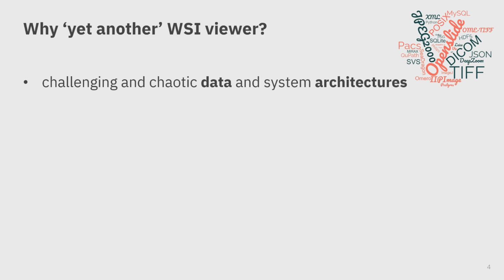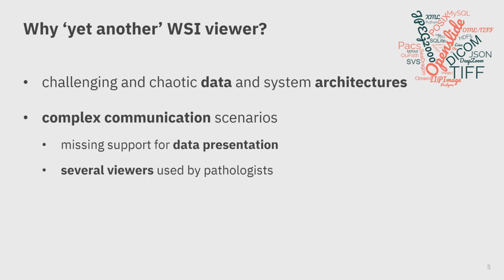We needed a viewer able to adjust to various, often ad hoc architectures. Commercial software is typically costly to adjust and inflexible. Ad hoc solutions usually consist of a combination of several software solutions, causing communication and compatibility issues, such as employing several viewers for different purposes.